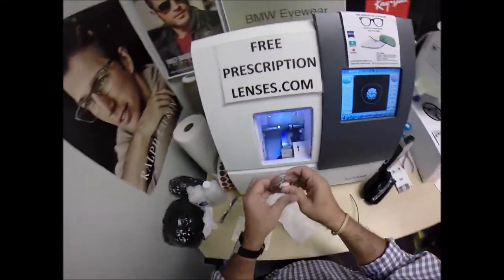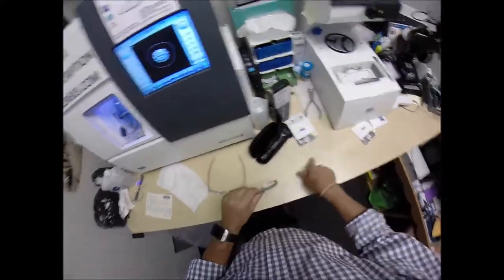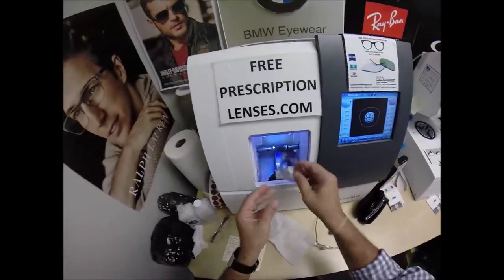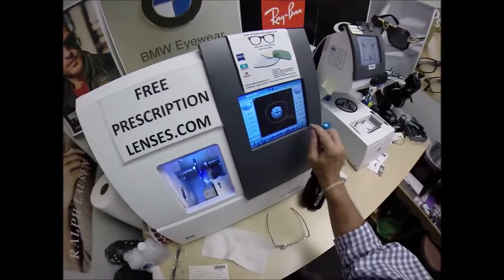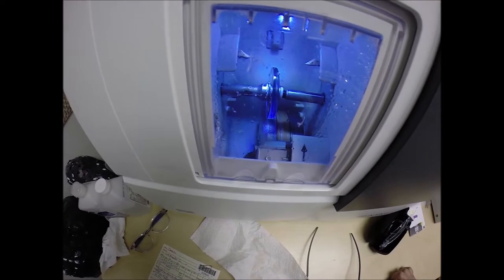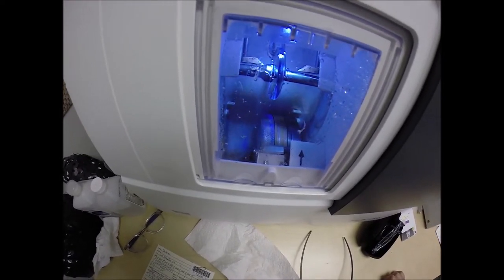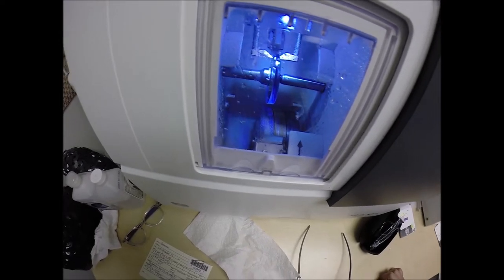So come back down here, press that sticker on there firmly this time. No more playing around with it, letting it rattle on the thing. And real quickly now, I'm going to hit the start button. The door closes, the clamp shuts. It's going to be traced again by the two white styluses, making sure that it's large enough to fit into the frame on the first go around.